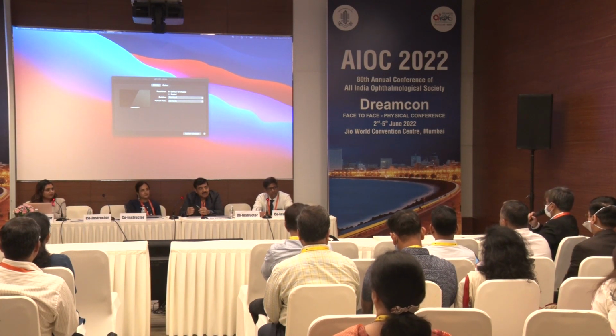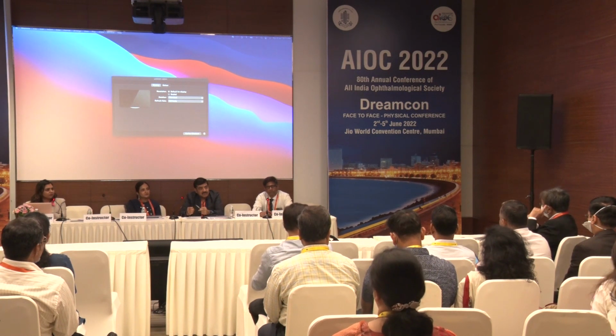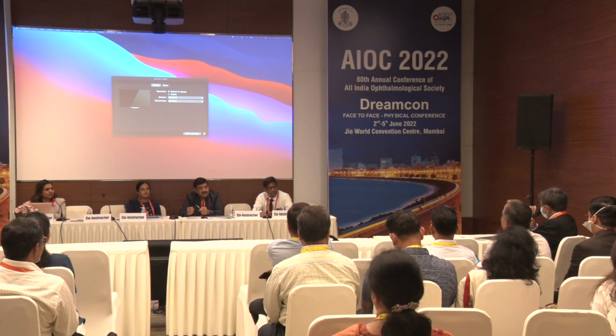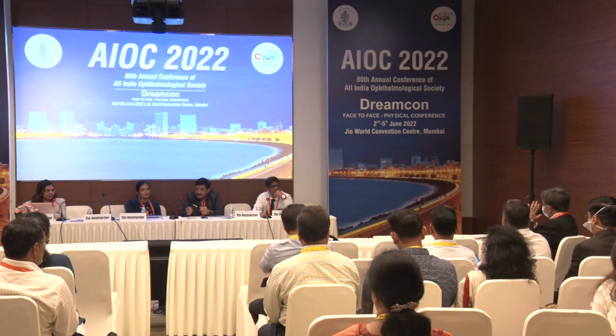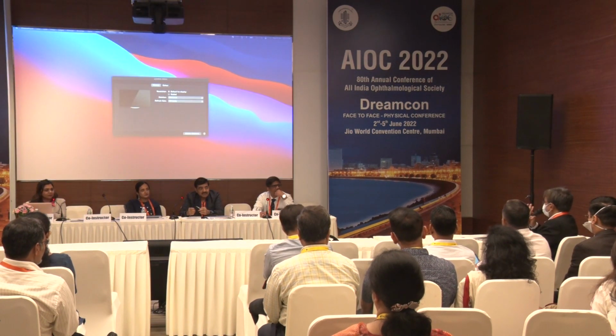But if the other eye's toric is corrected, be careful for the second eye: you have to correct toric even in low astigmatism, otherwise the patient will be unhappy. And in multifocals, you have to correct toricity even at 0.5, 0.6, especially with trifocals, as they are very sensitive.